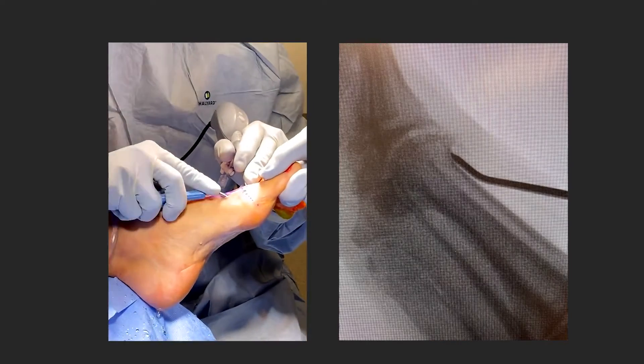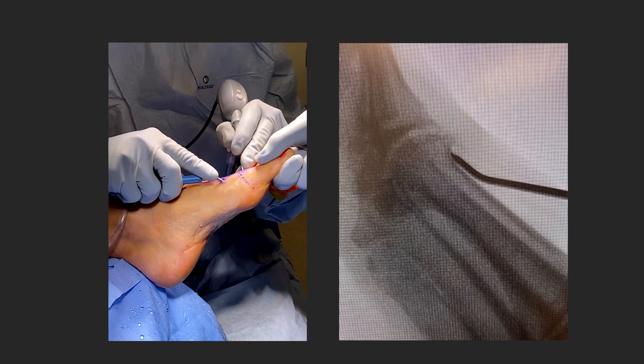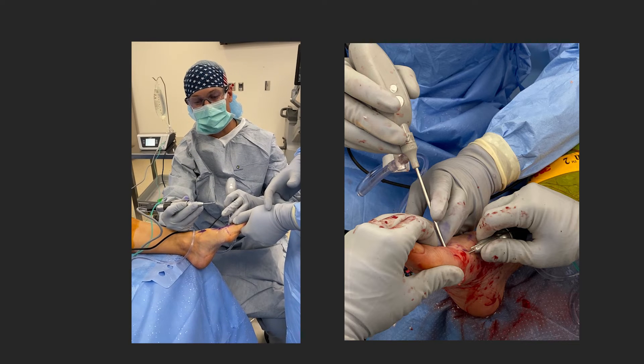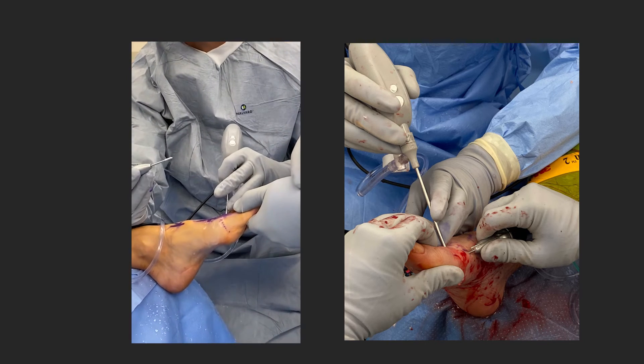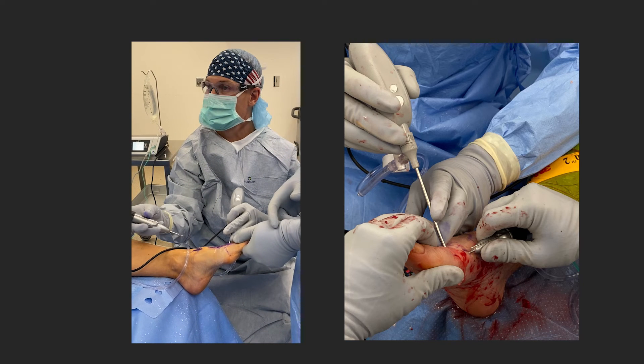Going forward, I make a small accessory dorsal portal, use the elevator from the MIS kit to elevate tissue from the dorsal osteophyte. Then we have our Shannon Burr — it's high torque, low speed, doesn't cut your glove, and is very safe. That's what we use inside the joint. On the right side of the screen you can see I use an overhand grip, which gives you good control.